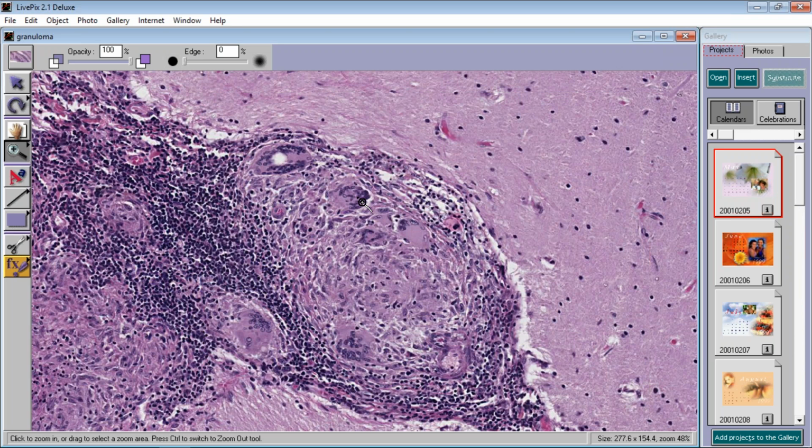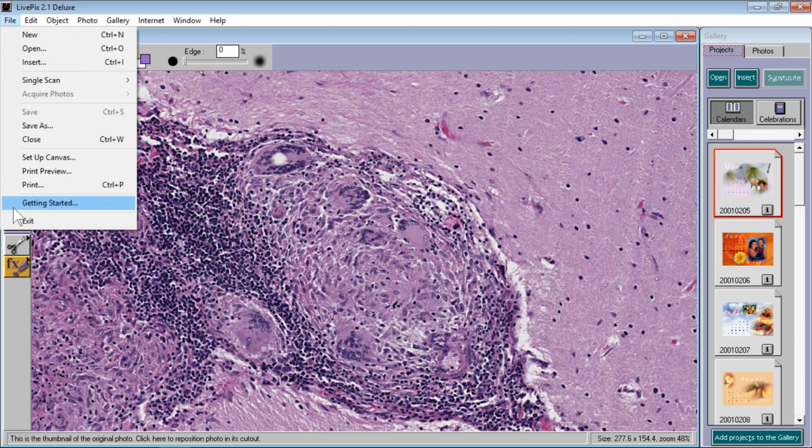Now, even though this could be tuberculosis or any granulomatous disease, a fungal disease, for example, or it could be the number one non-caseating granuloma disease in the body, which not only involves the lung like TB and fungi, but it can involve everything. This is sarcoidosis, okay? But we don't have to worry about that yet. We're going to get a lot on it later. Let's go to the next slide here.